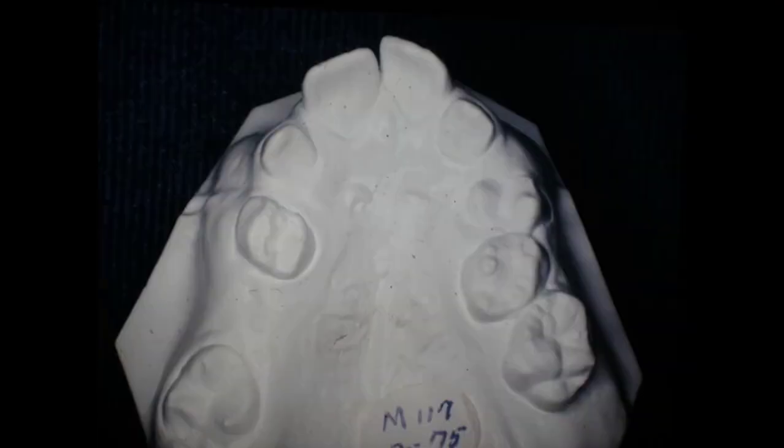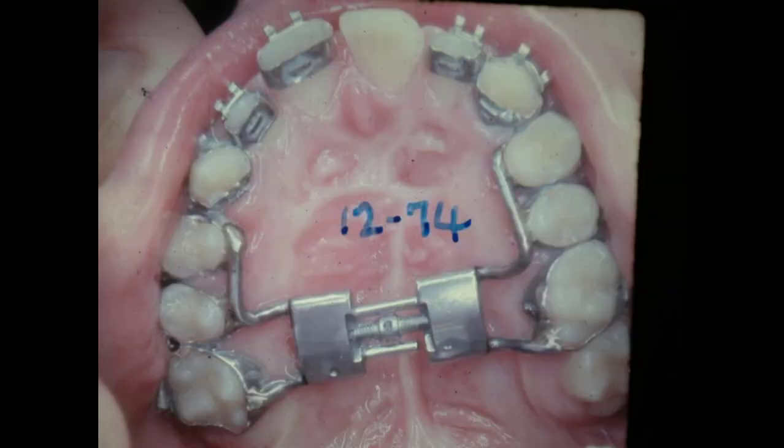Here is the palate when we started, and after we separated. I went back and did two of them. Now you can see the suture must have been worked on — this is scar tissue inside here. I didn't realize it at first. This was a spot; if I had put my finger on it, I could have felt it just gave. There's nothing but tissue over this part, but it's sealed off.